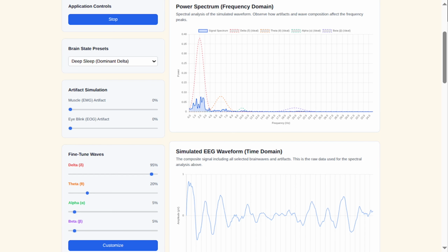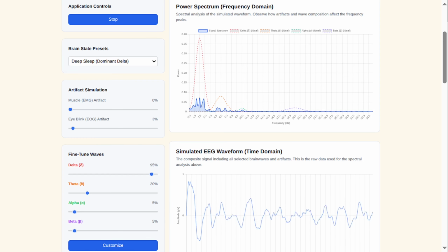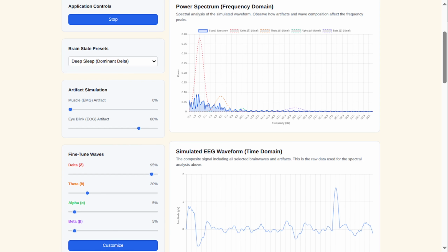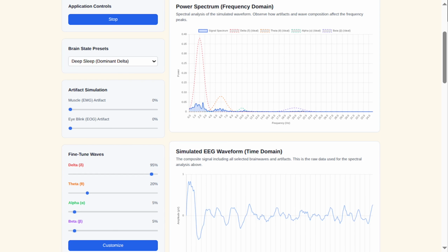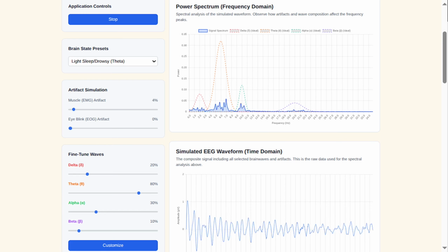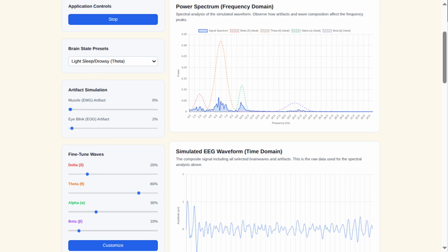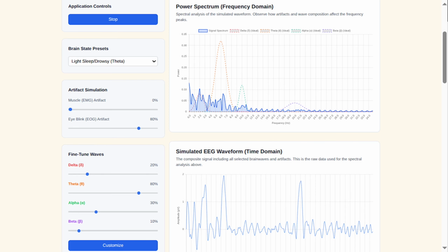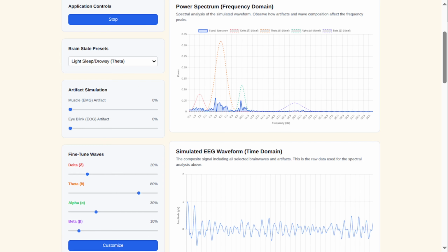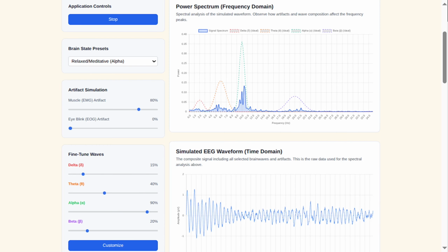But this periscalp, is the term periscalp correct? Periscalp isn't a standard term. The commonly recognized term is subscalp. That's the most accurate and widely used name in medical literature. What's the difference? The main difference is in depth and invasiveness. Subscalp electrodes are placed beneath the scalp but above the skull, while intracranial electrodes, like ECOG, are placed directly on the brain surface or even inside brain tissue. This affects signal quality, surgical complexity, and the level of invasiveness.